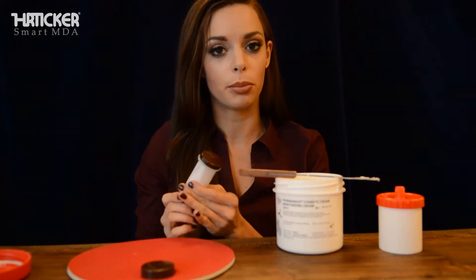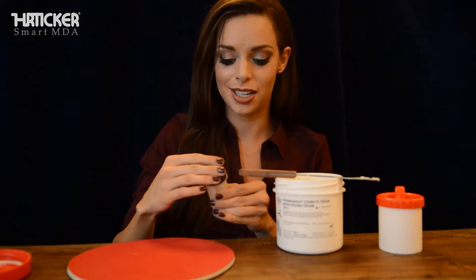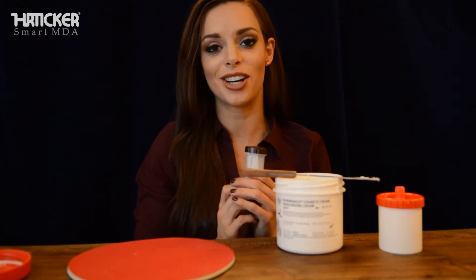At this point you're going to want to prime the unit for your patient. Just twist it up until you see the medication right at the top. Then put on your safety cap — and that is how you fill the HR ticker.